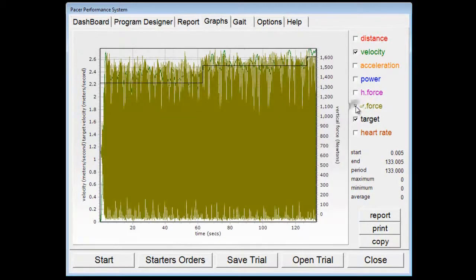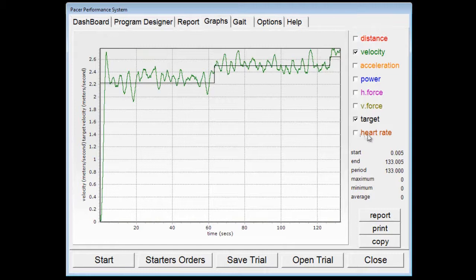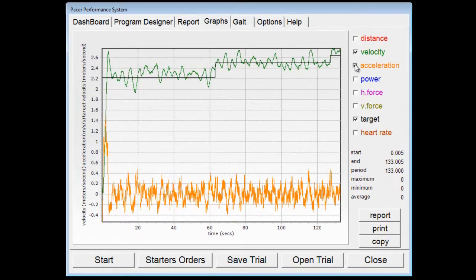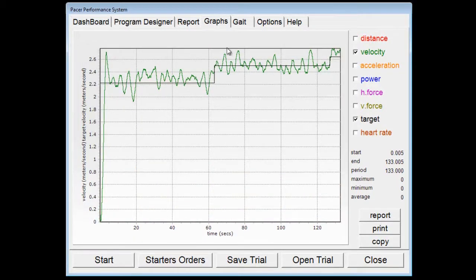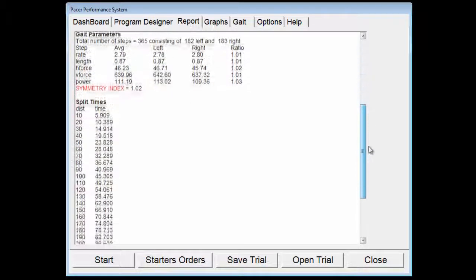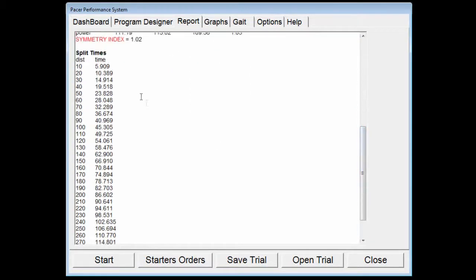You can also show vertical force. If they're wearing a heart rate monitor, you can click on heart rate — there wasn't one worn in this case, but it will show up on the graph as well. You have a distance timeline and acceleration. You can also click the report button, go to the reports, and it will give you their average velocity, peak velocity, average power, peak power, average horizontal force, peak horizontal force, average vertical force, and peak vertical force. It will also give you the time of each of those peaks, and their split times for each of the 10-second intervals.